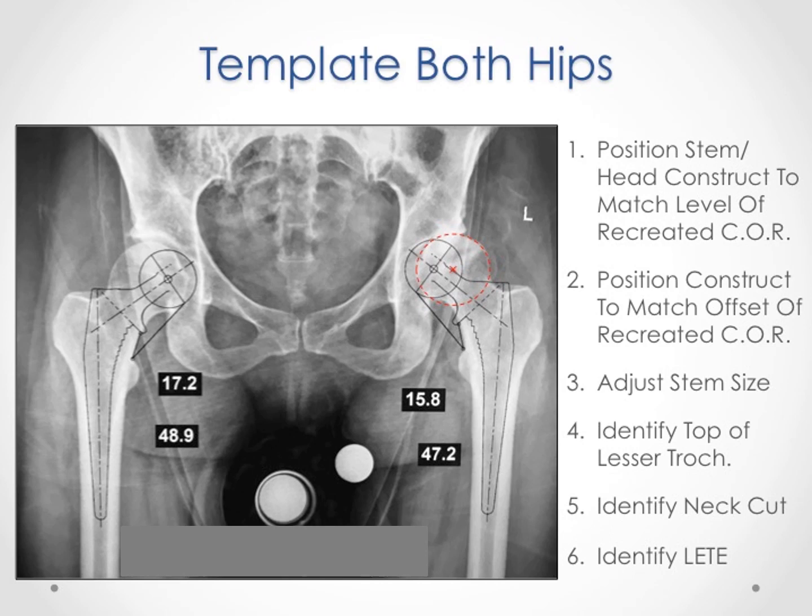We refer to this number as the LEDY — an acronym for lesser trochanter to equator of the femoral head. The level of the neck cut above the top of the lesser trochanter and the LEDY become the roadmap for the procedure. This is the neck cut number, this is the LEDY number — a roadmap that is unique to each patient. And since we template both hips, we follow the numbers generated and compare them to the non-operative hip. This way, the LEDY and the neck cut on the operative side will match the non-operative measurements and will recreate symmetric offset and even leg lengths.